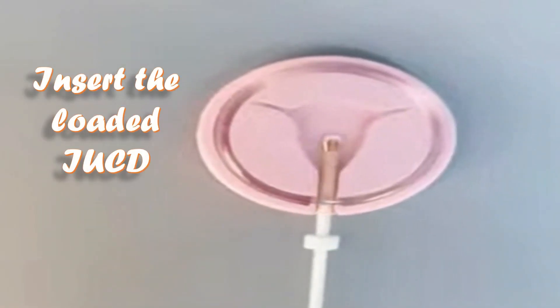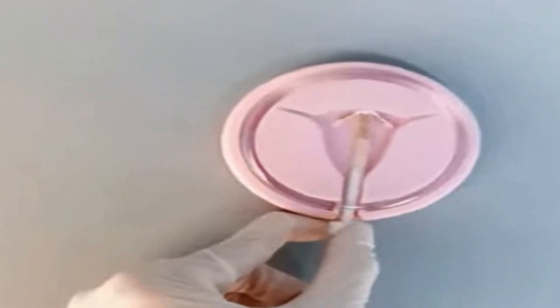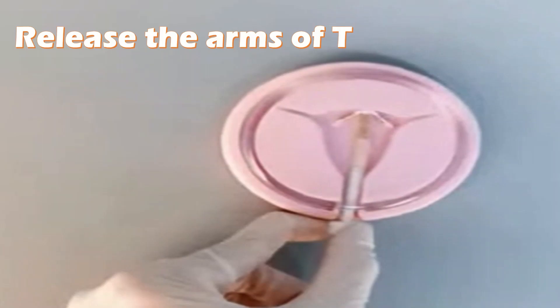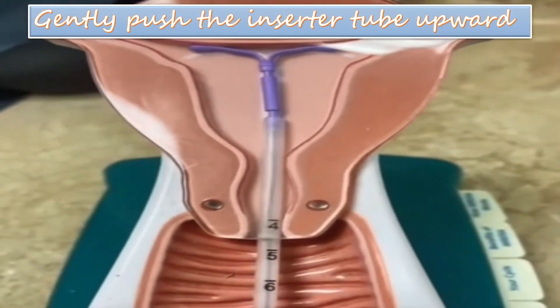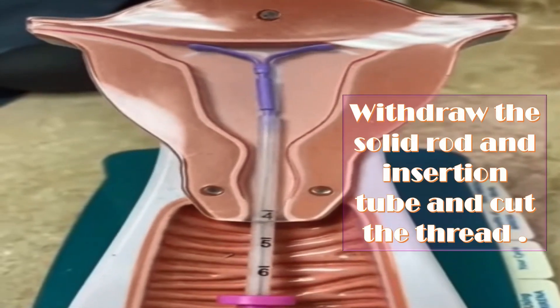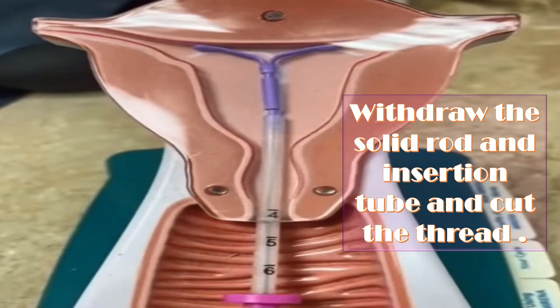I will insert until the blue gauge touches the cervix — that gauge can be of white color as well, as you can see here. I will hold the solid rod stationary and pull the insertion tube backward until it touches the bar of the solid tube; this will release the arms of the T. Now gently push the insertion tube upward until slight resistance is felt, to ensure it is close to the fundus. Then I will withdraw the solid rod while keeping the insertion tube stationary.